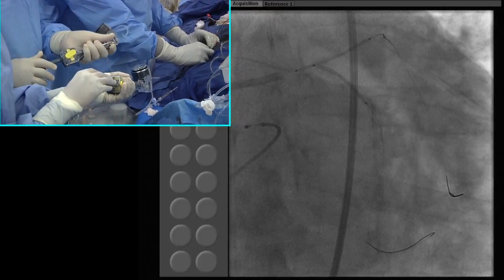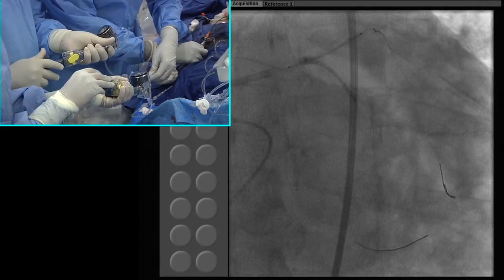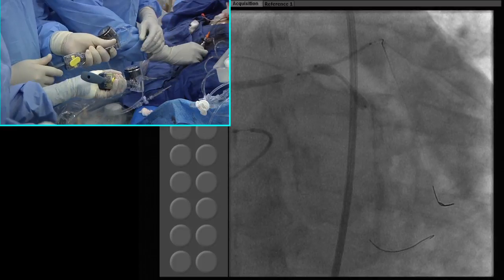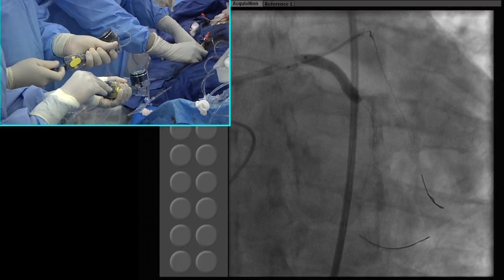I'm going up. Okay, circ, we are going. It is the 4020. A little bit too much in the left main, but that's okay. Expanded very nicely there. Okay, down. 40.